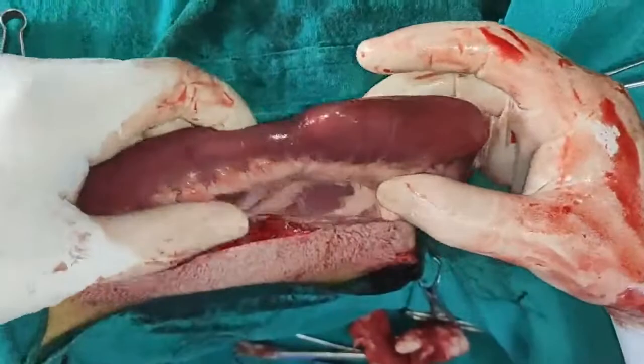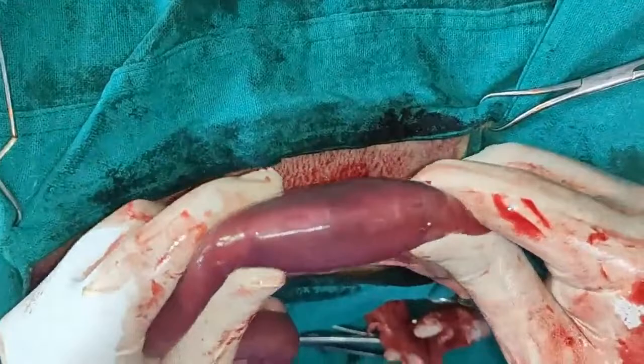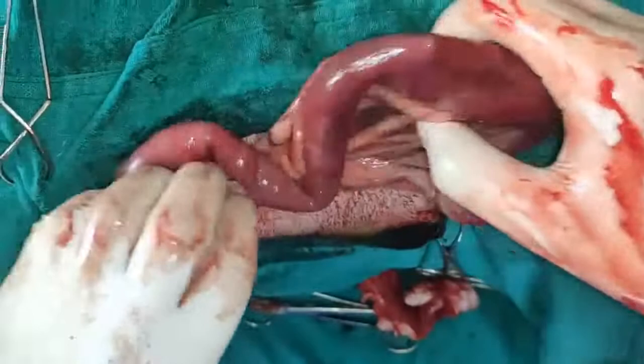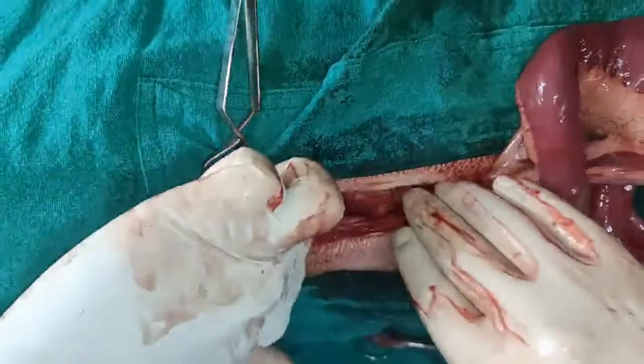So you can see the intestine is okay here, but slightly here it is bluish. You can see it is passing, but not properly. So it is 14 days old. It is not able to pass properly. It is in the small intestine. That is why. Then I also have to examine the stomach just to rule out whether there is something in the stomach.